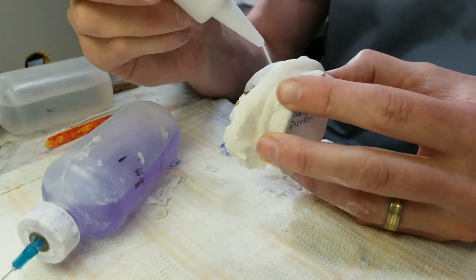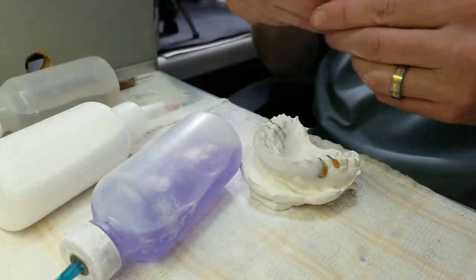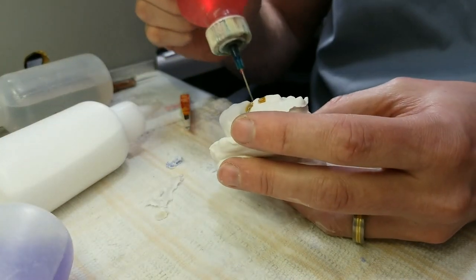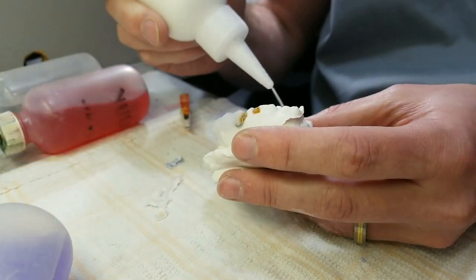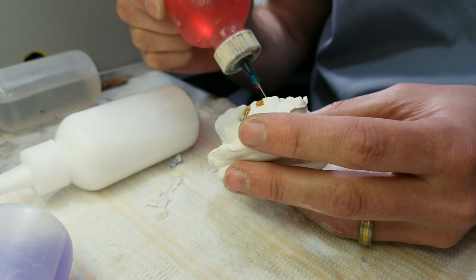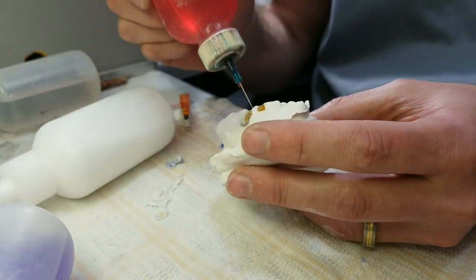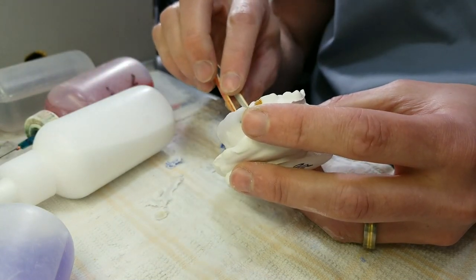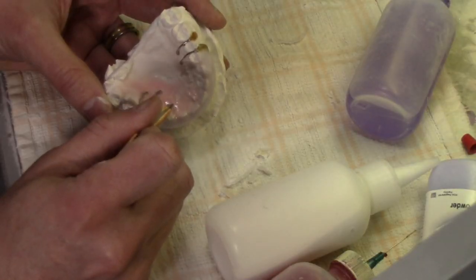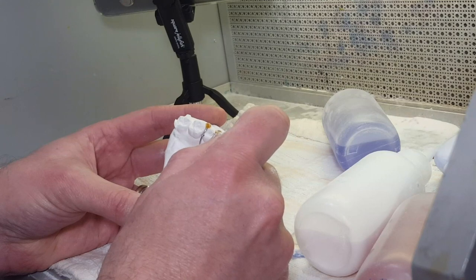If you're in dental school, I hope you're getting plenty of lab time. Put in the name insert, switch to my pink monomer. Put a layer of pink down. This camera behind me probably needs to be a better angle.